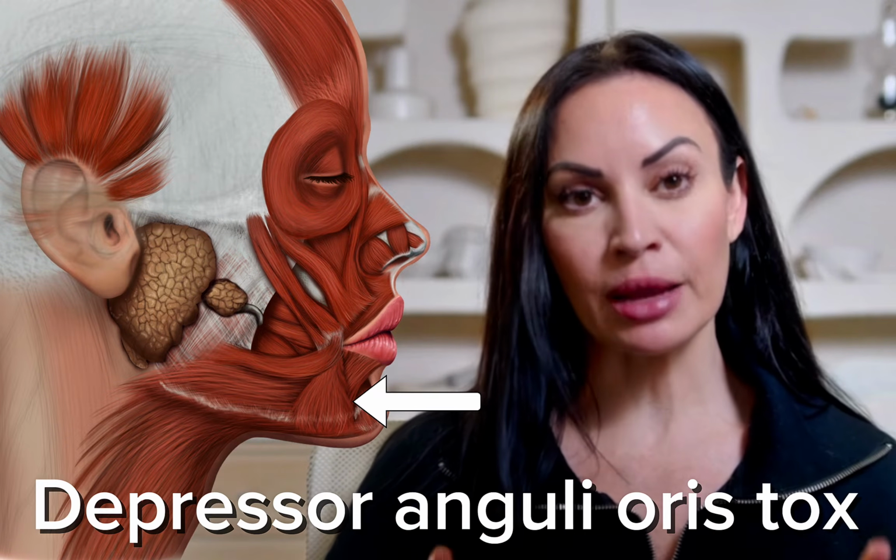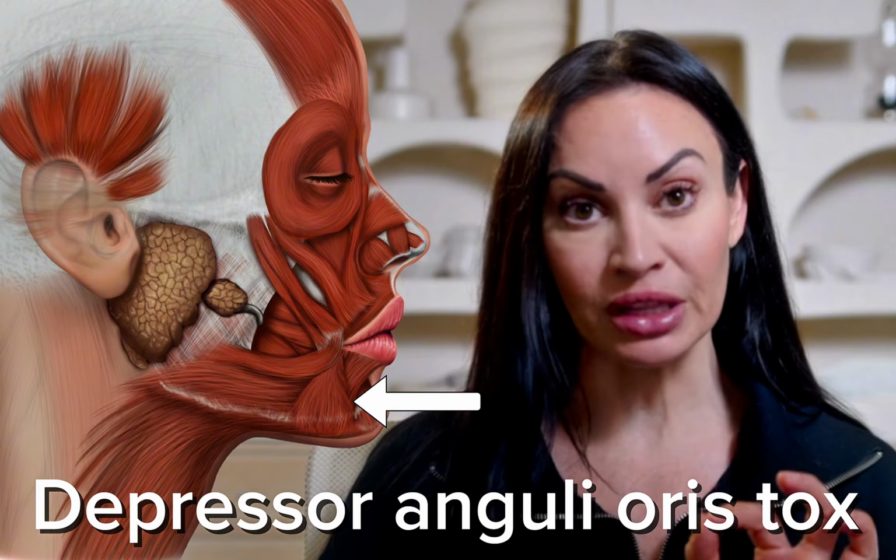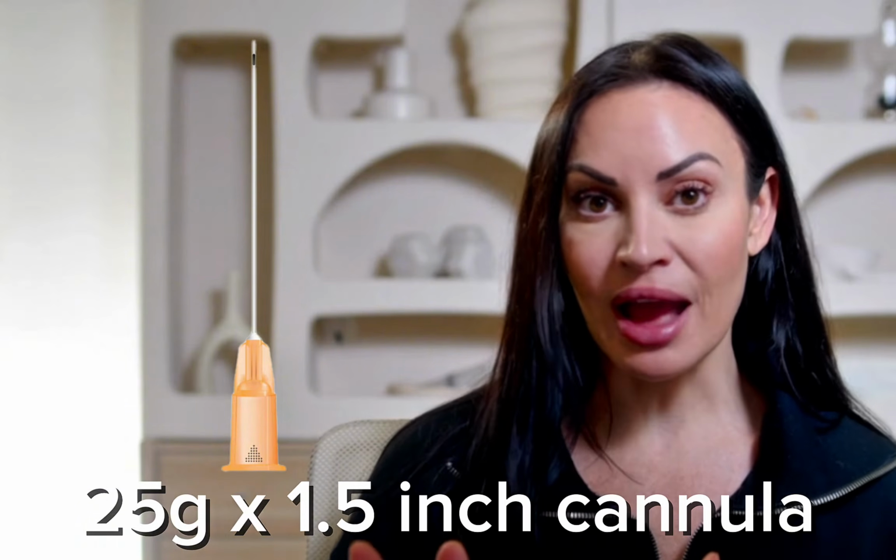I'm not saying it's dramatic, but I think that in combination with a little bit of filler can be a great option for patients. I like to go in with a 25 gauge by 1.5 inch cannula and place a little bit of filler and perform a little bit of subcision in this area. Now, with that being said, if a patient has really dense tissue in this area, for example, if they have really meaty jowls or really heavy dense jowls, I always tell them, because over medial to that dense jowl is going to be that marionette line, right? So they have this dense jowl and medial to that marionette line, and then it falls into the chin.